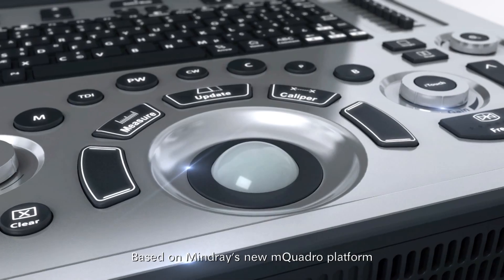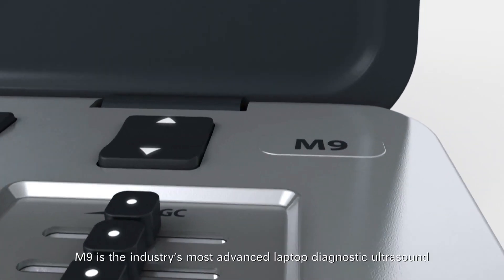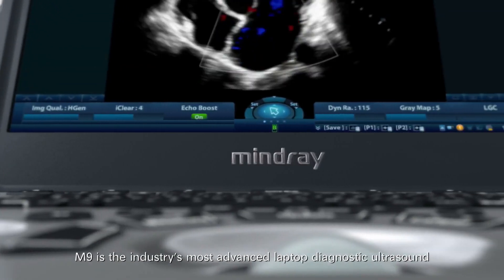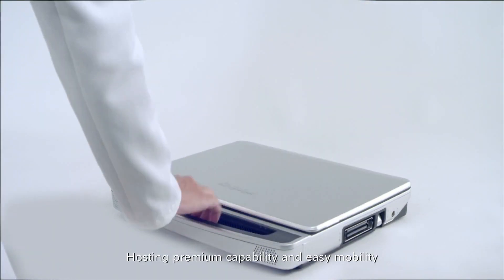Based on Mindray's new mQuadro platform, M9 is the industry's most advanced laptop diagnostic ultrasound built for your unique requirements, hosting premium capability and easy mobility.